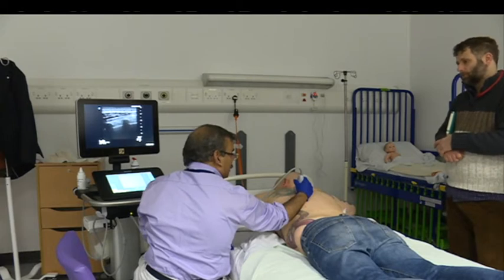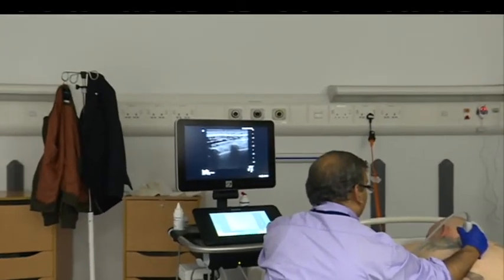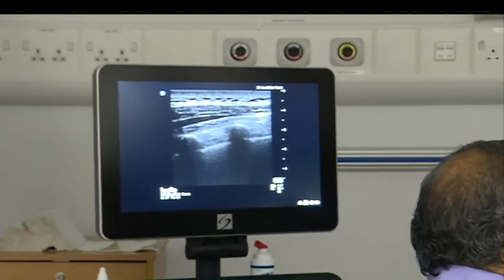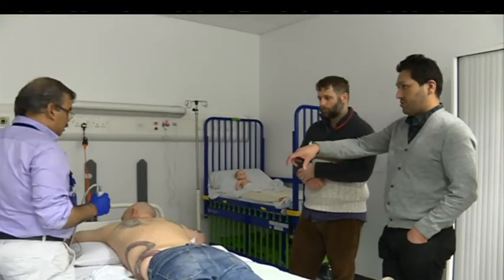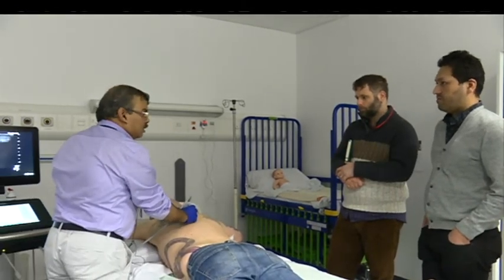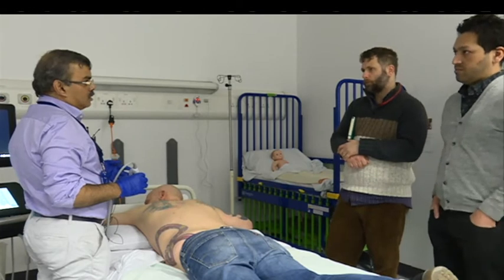Never cut those catheters — they are not MRI-friendly, so you cannot take the patient to MRI. Where I suspect the patient might need MRI, I use the normal Pajunk Sonolong catheter which has a metal guide wire that is removed once you have positioned the catheter. I always approach transversely, coming from lateral to medial — that is the normal technique, but sometimes if you find it difficult you can try the longitudinal technique.